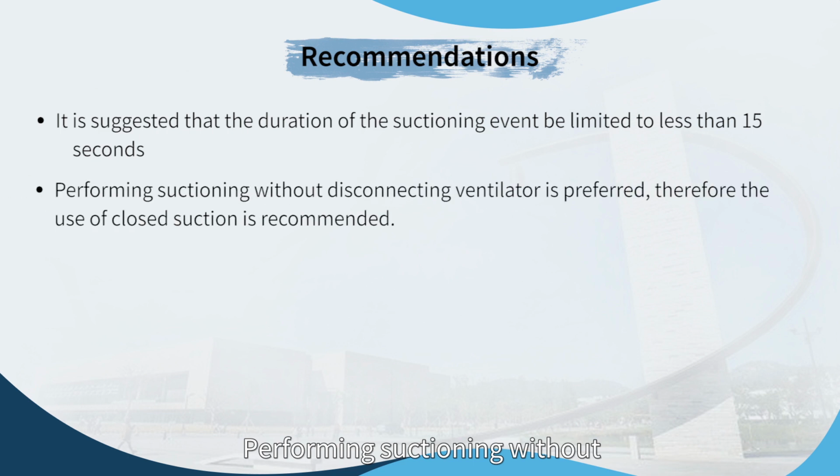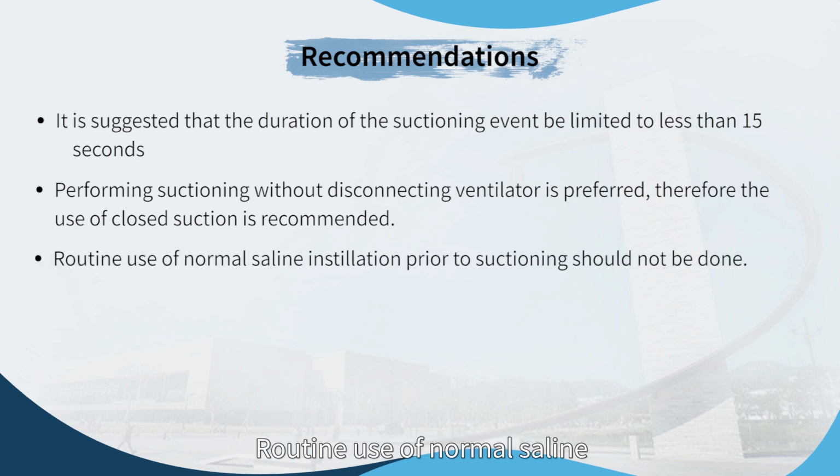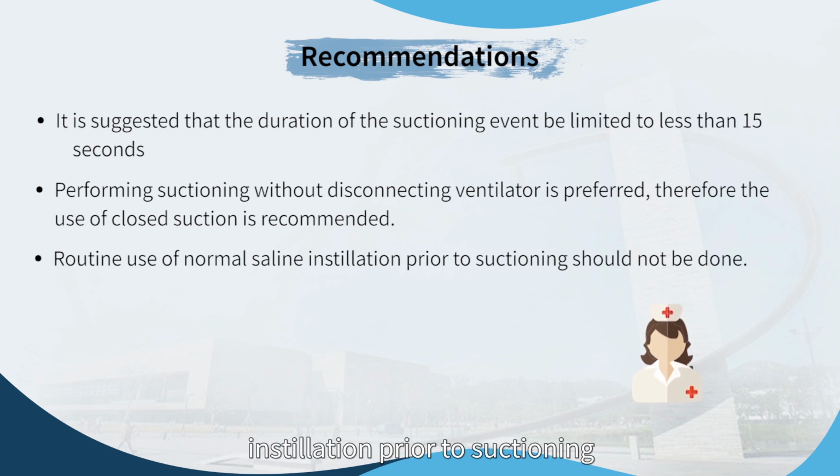Performing suctioning without disconnecting the ventilator is preferred. Therefore, the use of closed suction is recommended. Routine use of normal saline instillation prior to suctioning should not be done.